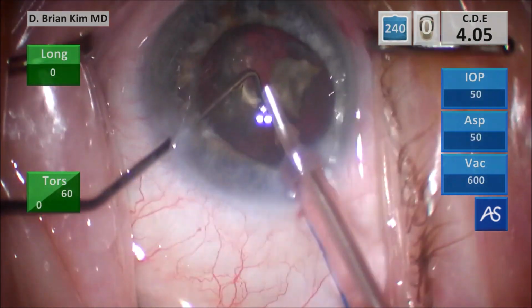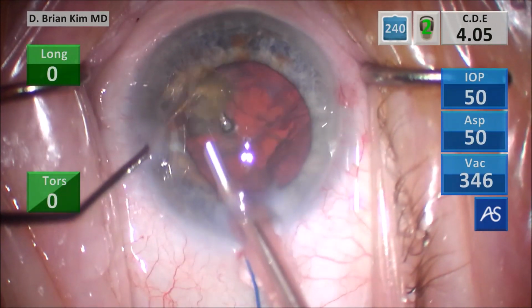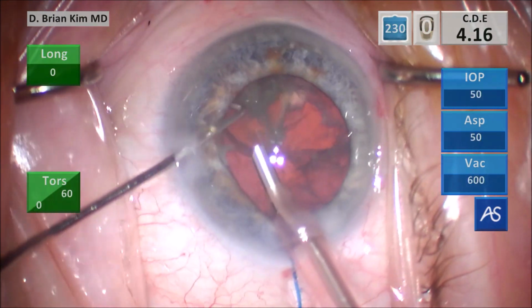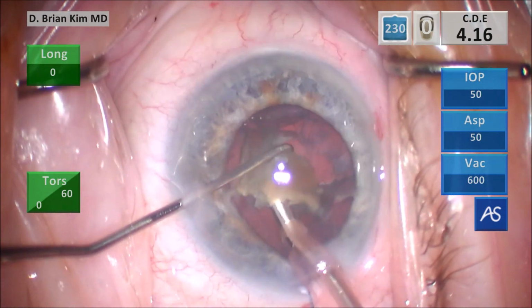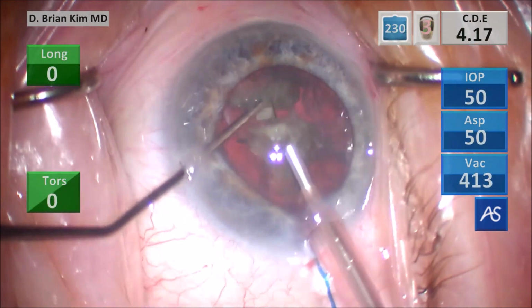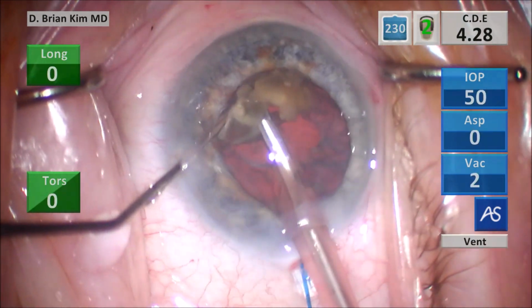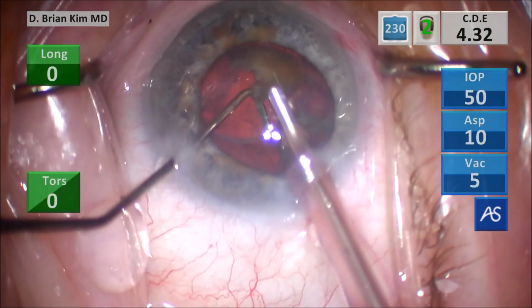Again, these are such dense lens pieces. When you do this technique, you can feel how dense the lens piece is. It's like if you had your fingers and you were squishing a piece of rice, you can feel the softness of the rice between your fingertips. But if you had an uncooked piece of rice, and you're pushing that between your fingers, you can tell it's hard. When you're chopping these dense lenses, you can feel how hard it is because as you bring the instruments together, they don't want to come together. But then as you squeeze the lens, suddenly there's a loss of resistance and the lens is fractured. And so, again, it's such a gratifying sensation.